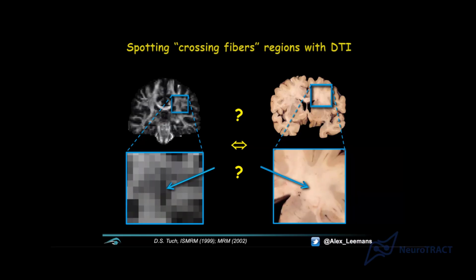Because I mentioned in white matter, you've got structure, highly organized fiber tissue. There, the diffusion should be very anisotropic, so the FA should be high. Why do we still see a low FA region in there? I mean, is that like a lesion, some pathology? I mean, I hope not, because that's my brain, right, on the left. So no, it's not a lesion. As far as I know, I'm still healthy. What's going on there? And it was actually mentioned in the comments in one of my previous lectures about that.